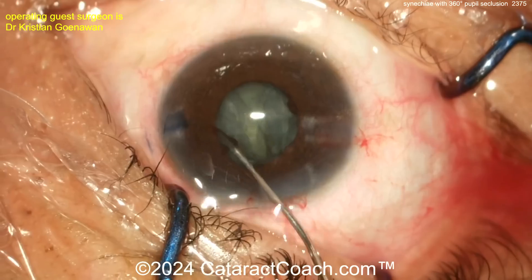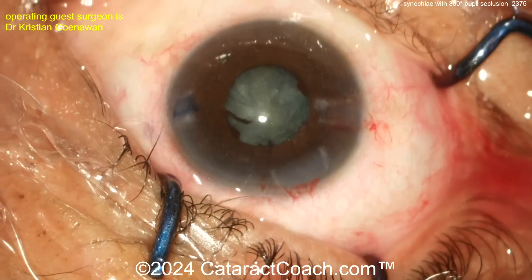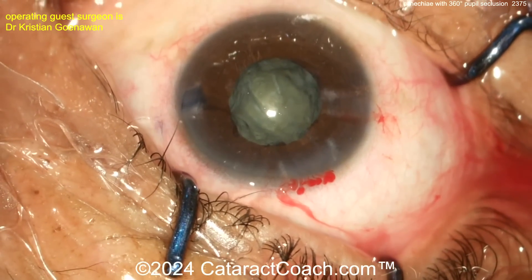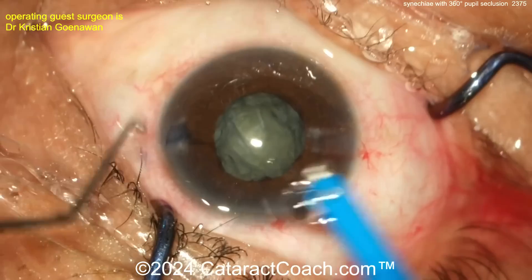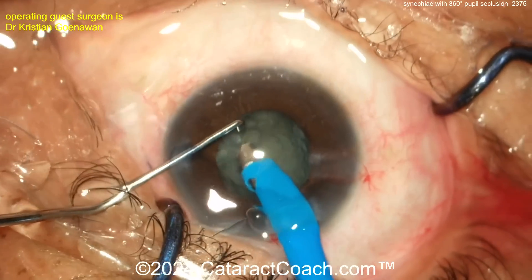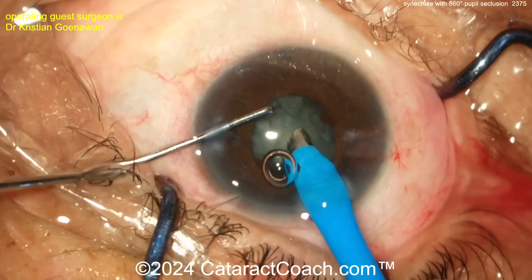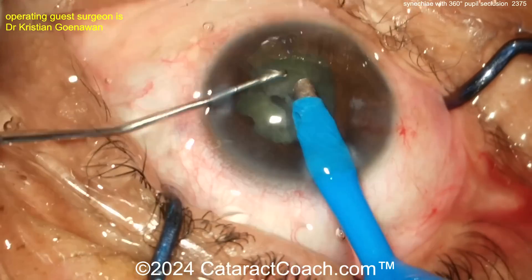You may want to chop in the bag, or do a groove down the middle with a stop-and-chop. If you groove down the middle, make the groove double-wide to debulk the nucleus. A little more viscoelastic goes in — good thing we like viscoelastic. Going in with the phaco probe and a chopper — looks like a vertical chop technique. Vacuum up the anterior lens cortex, and for the nucleus it looks like a tilt-and-chop.